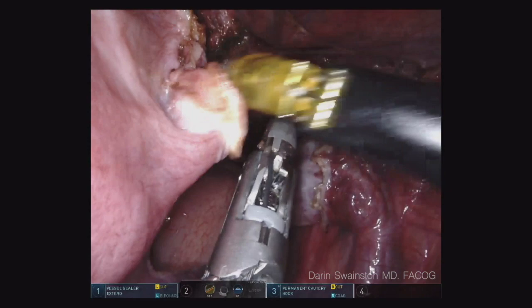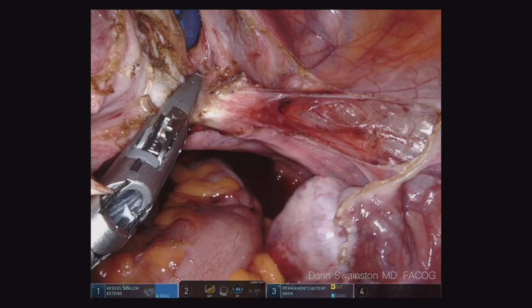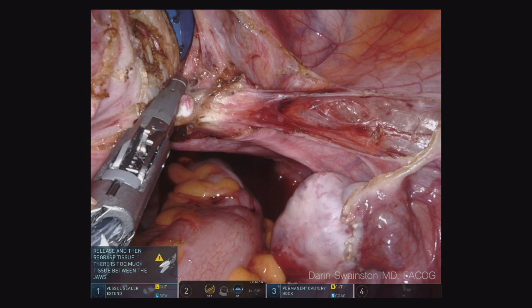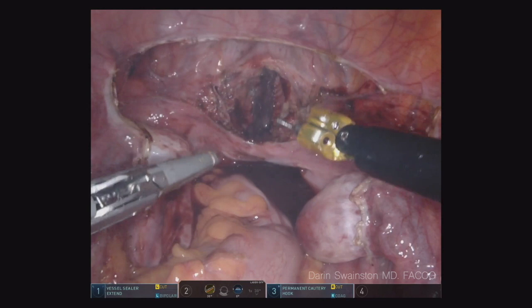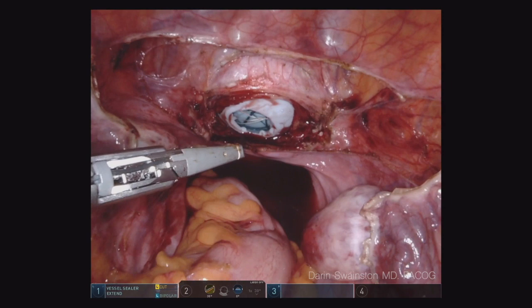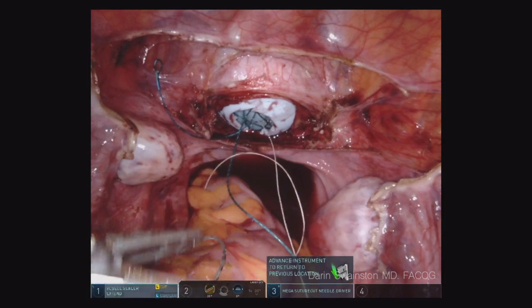Now I'm going to just bounce off the colpotomy ring. My only advice while watching this video is I should have done one more pass — you'll see why here in a second. There's a little vessel left over and you can see I cut through the lumen of that vessel — that's going to ooze a little bit. It'll be taken care of when we close the cuff, but for a better technique it should have been done a little differently. But you can see there's almost no blood loss. That fluid down in the pelvis was already there from the beginning of the case.